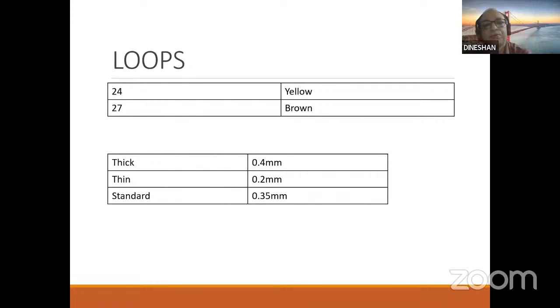Now coming to the loop. As I have already mentioned, there are two different types, the single stem and double stem, but it doesn't make any difference actually. Even the double stem is active. There is only one active stem, the longer one, which is directly connected to the high frequency cord. The other stem is always there for stability.